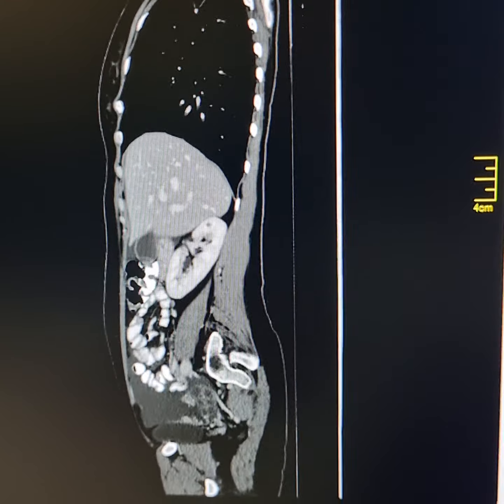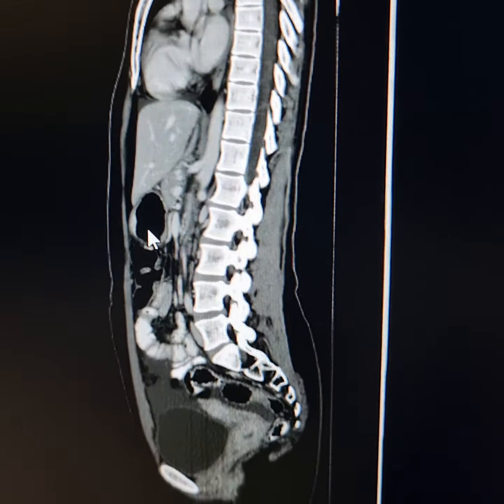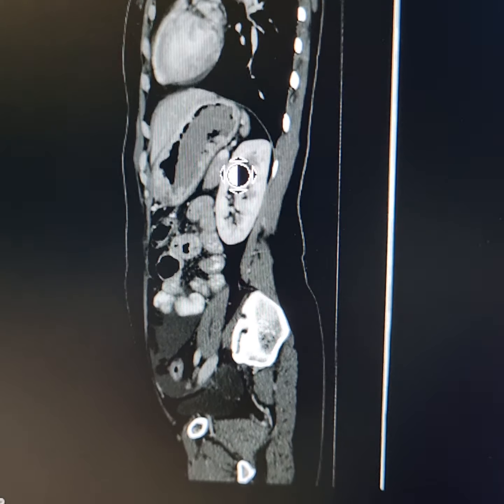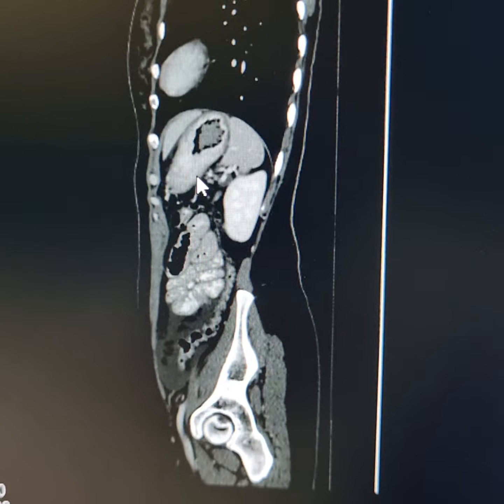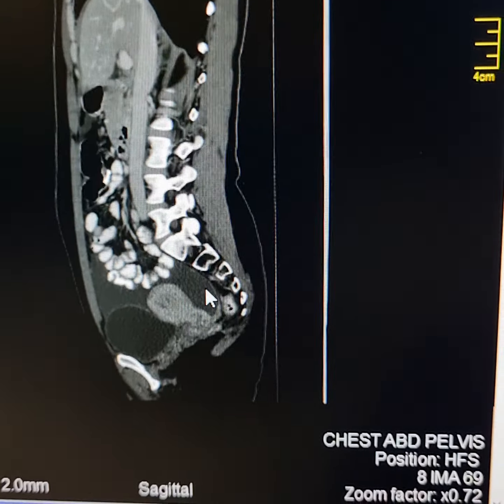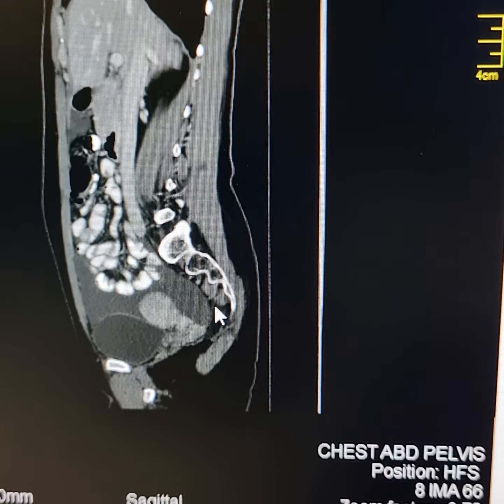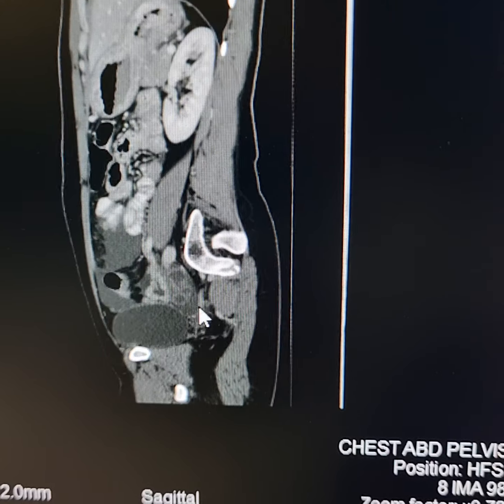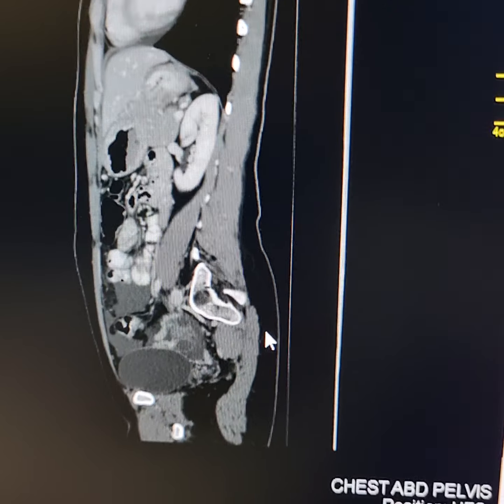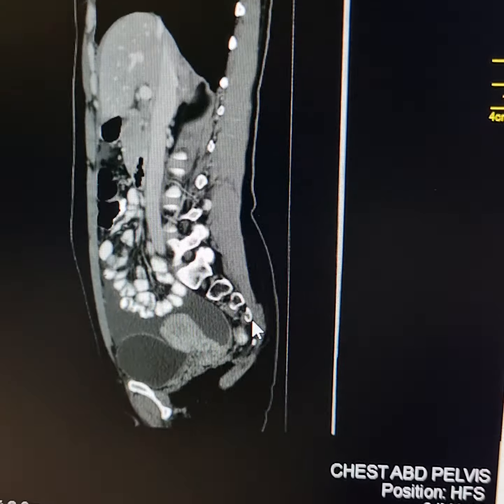This is the CT scan. Please see the thickening of the wall of the stomach in the region of the pyloric antrum. Now observe the thickening of the wall here in the regions of the body and fundus of stomach. This is the uterus here with a few small intramural fibroids. This is the right ovary — quite prominent looking. This is the left ovary here. The likelihood is that the thickening of the greater omentum is also metastatic. The patient has developed mild ascites and bilateral ovarian metastatic lesions suggestive of Krukenberg tumors.